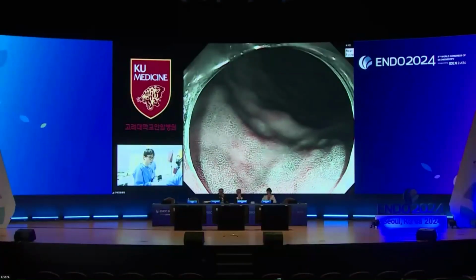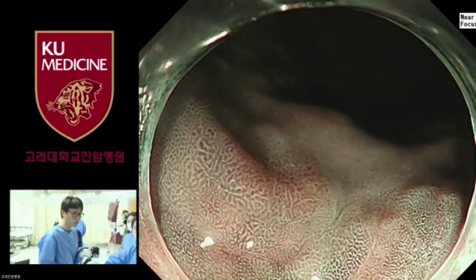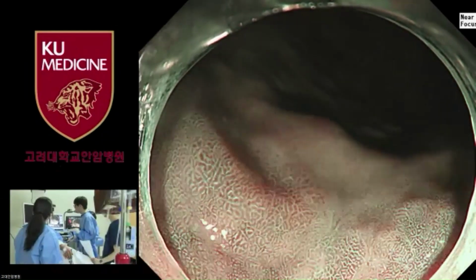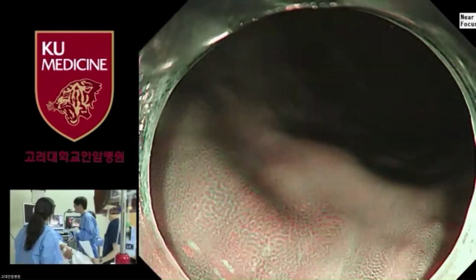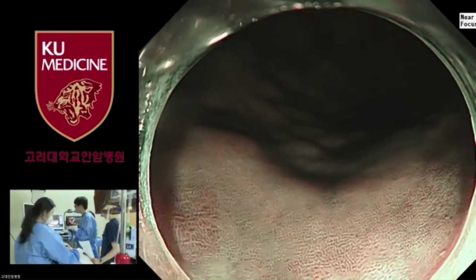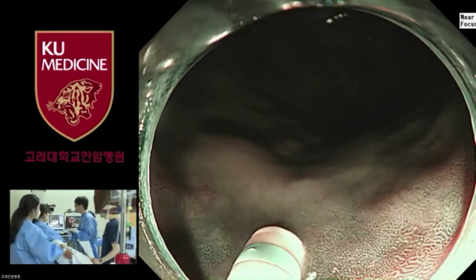How many centimeters is the lesion? It looks very big. Yeah, I usually do the circumferential marking at a distance of 2 to 5 millimeters from the target lesion. So if I mark this lesion, I'll mark at this point. The size of the lesion looks like maybe 2 centimeters, I think.